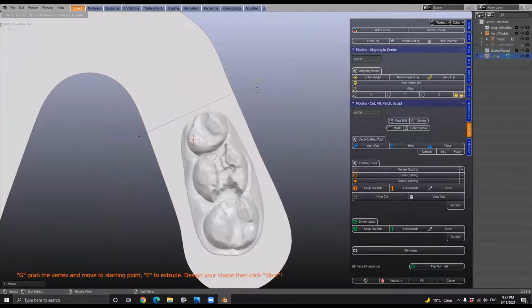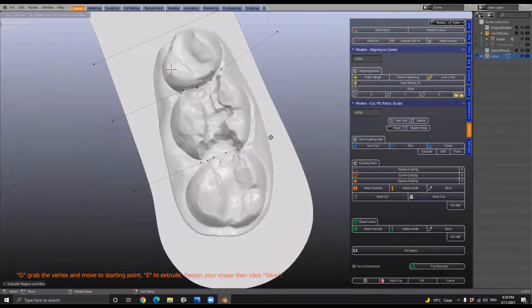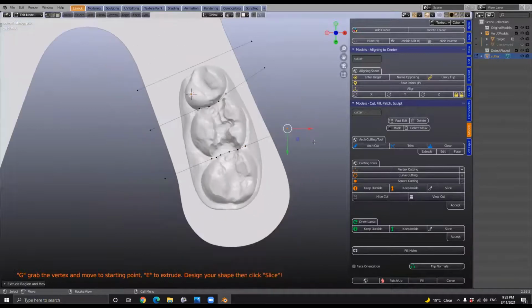Just by the way, the length of the actual insert is 16 millimeters long, while the entire base is 18 millimeters. So that just gives you an idea of the length of the actual inserting piece into the plastic injection mold.